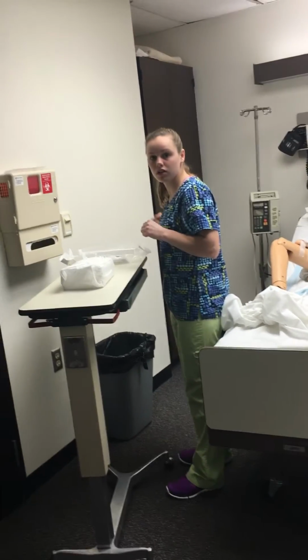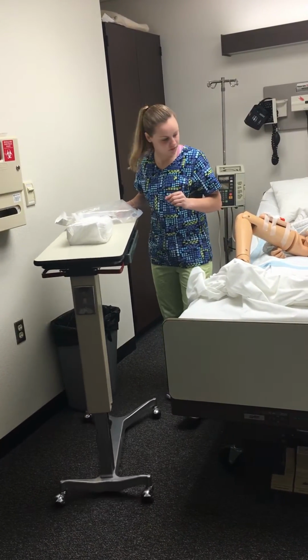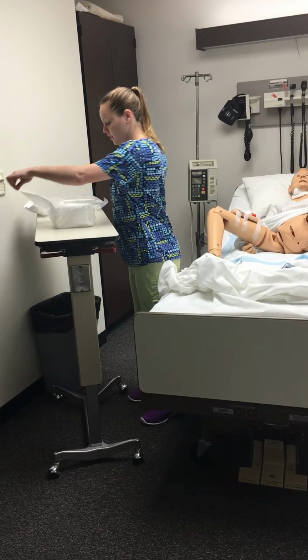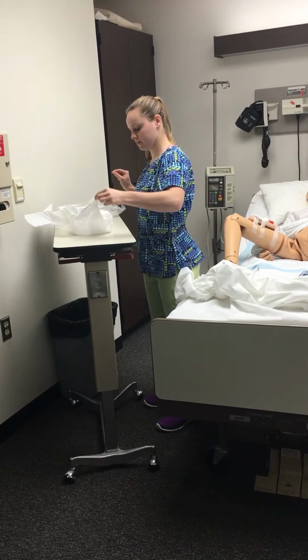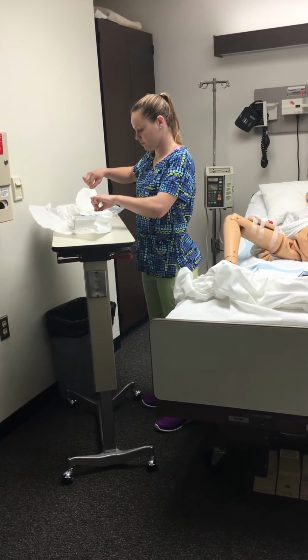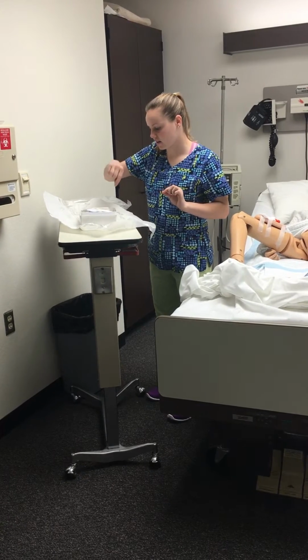Get the table more towards you so you don't turn your back on it. Okay, and so now I'm going to establish my sterile field, holding only the corners. And then we'll get my gloves on.